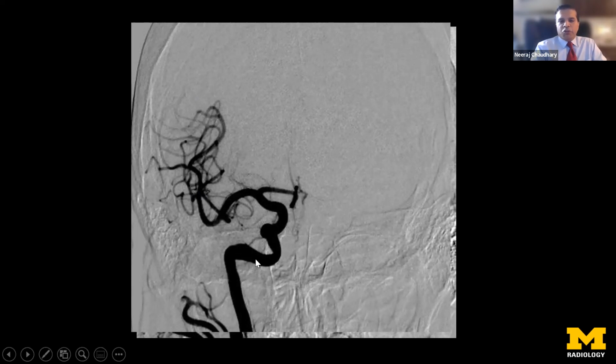extracted. Usually, if it happens, there is debate about how long it takes to open up a vessel. There are mechanical devices, stent retrievers. We'll take a look at that shortly, but it's difficult to go deep into those discussions. But just to say that it's not rosy all the time as this, that the clot comes out with one pass or one attempt, one suction attempt to extract the clot. Sometimes they're obstinate, they don't come out well, and complications happen. So all of that is part of life that we face.